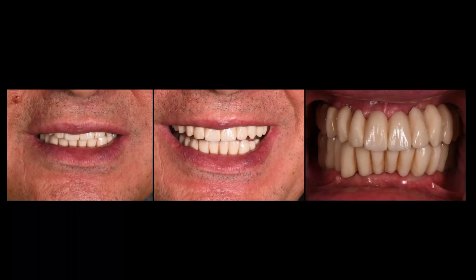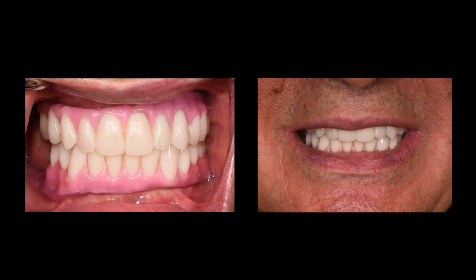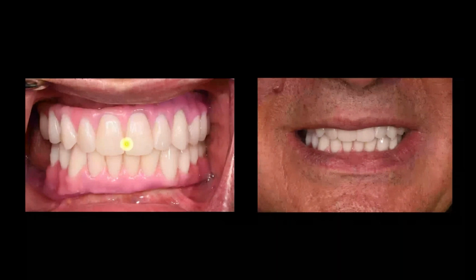And if you look at his repose position and the support of the lip, everything looks pretty good. And in his big smile, he doesn't really show a tremendous amount, but in a real Duchenne smile, when he gets up there a little bit higher, you're going to notice that he's not showing any papillae. And that's going to make the teeth look a little big, a little horsey. So we decided to bring this back and go more into the denture world and say, rather than treat this as a crown and bridge case, he's going to need some pink. Pink is normally 35 to 40% of the tooth. So if you're showing more than 4 or 5 millimeters of tooth structure without showing pink, you have a problem. You have a disharmony that doesn't really work for us.